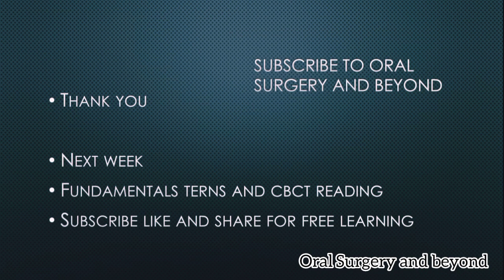So today we have covered the basic introduction, scan patterns, basic terminology, and advantages and indications of CBCT. In my next CBCT video, I will cover fundamental terms and CBCT reading on actual cases and treatment planning.